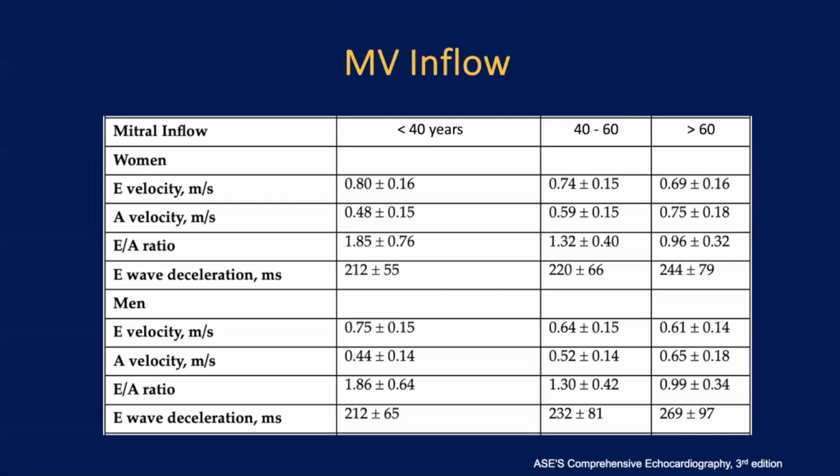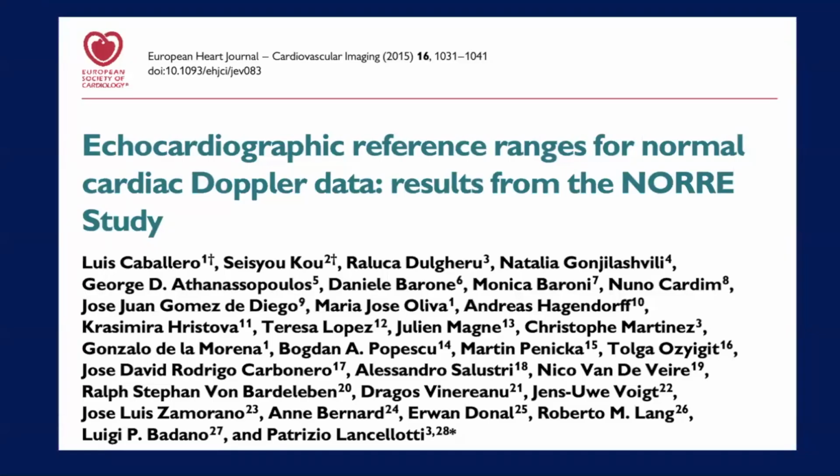What does it mean, and why is it high, and consider other things, for example, if we are doing stress echo, we usually take the inflow. If the inflow is higher than this, like 120, it's good to take also the TDI. Maybe this patient's shortness of breath that is coming to the lab is because of the diastolic dysfunction, not because of ischemic or other reasons.